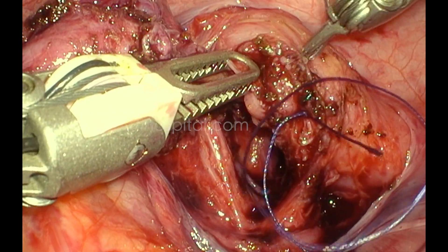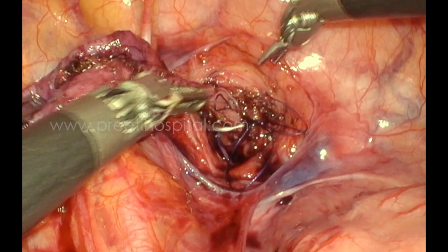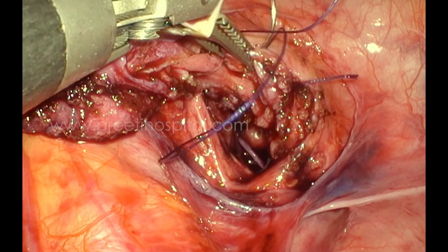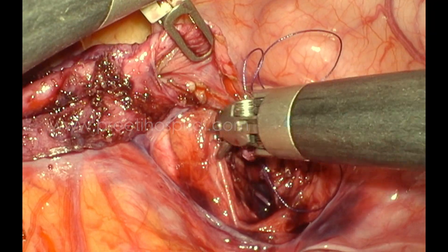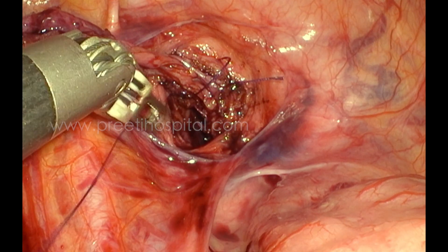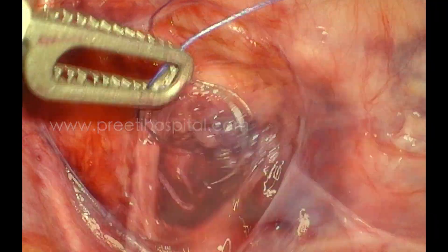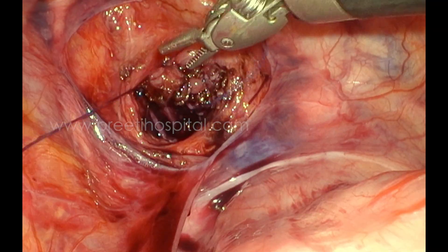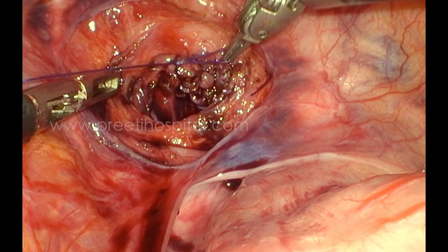A complete through-and-through bite of mucosa and muscle was taken so we could properly evert and take a complete bite, ensuring nothing was missed. The small diverticulum was left with attachment to use for pulling, then cut off with cutting and coagulation current. We considered a second layer but it was not necessary since detrusor and mucosa were taken. When planning the posterior layer, the ureter was identified just posterior to the diverticulum.